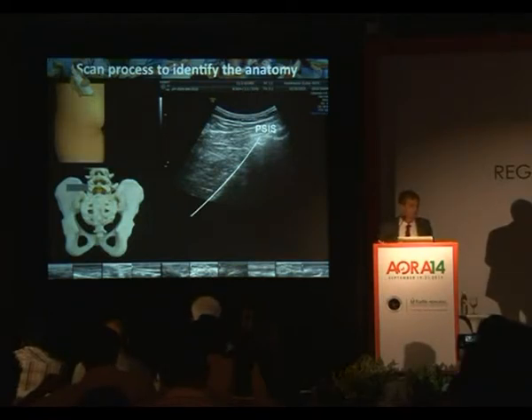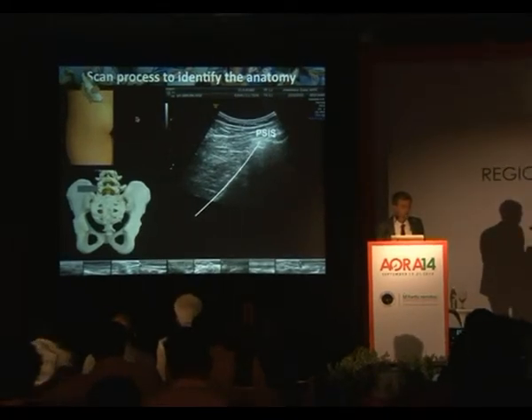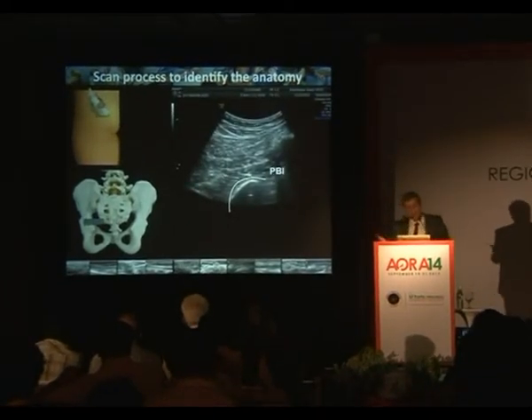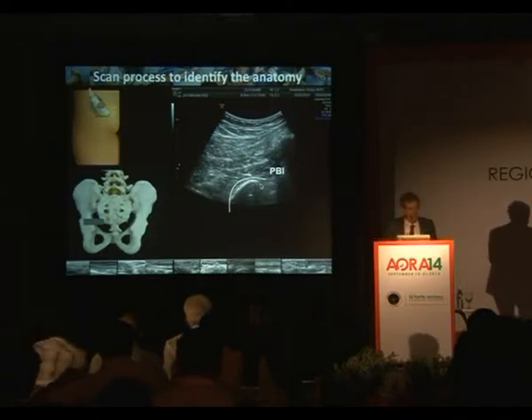So as we're going to ski, we're going to go down. You see that my probe is horizontal, and I'm going to go strictly down, caudally. And suddenly, I will have the posterior part of the bone ischiatic, the posterior border of the ischium. So my line will have a rupture, and suddenly this echogenic point. That means that I have to turn my probe. That means for me, stop, you are at the right level of the buttock, you just have to turn.